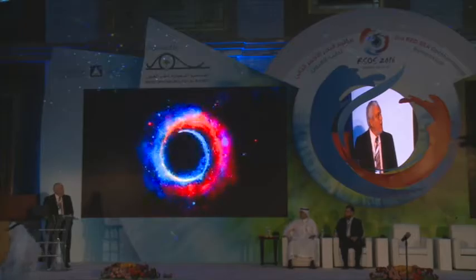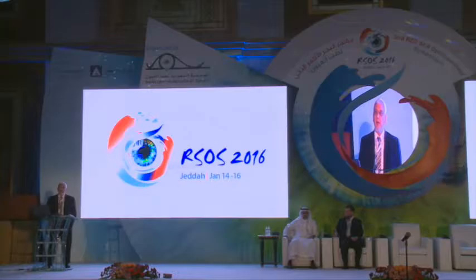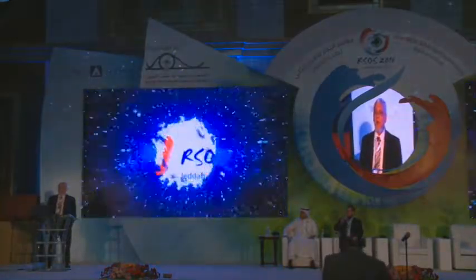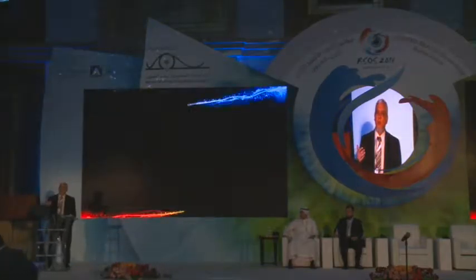When architects or engineers program and plan a building, they have to make topography of the land, using a referential value, zero, probably the street. We have different shapes that we use as referential: spheres, best-fit toric aspherics, aspherics. But topography is a general word that can be applied to both surfaces of the cornea and to both types of topography, curvature and elevation. That's the first point for discussion later.